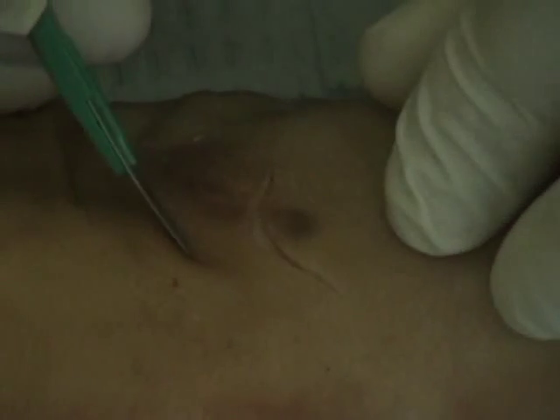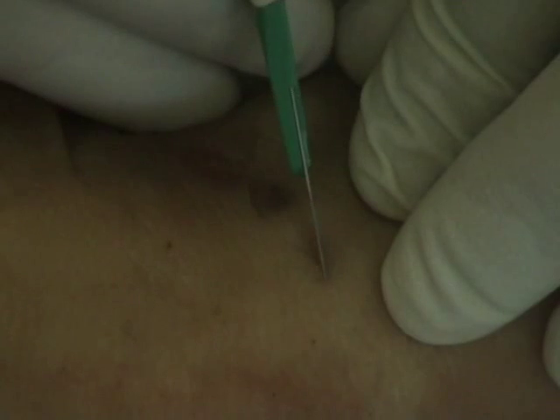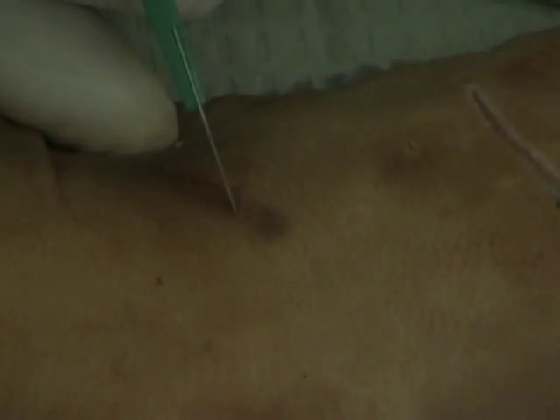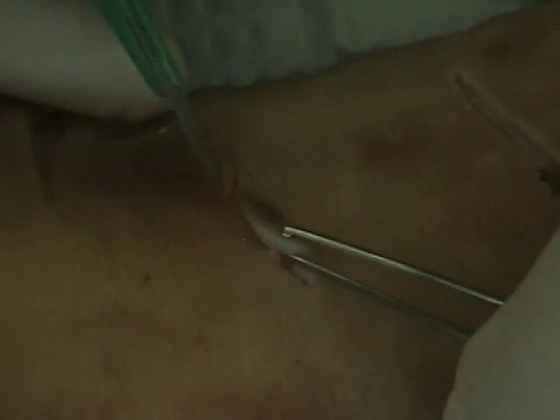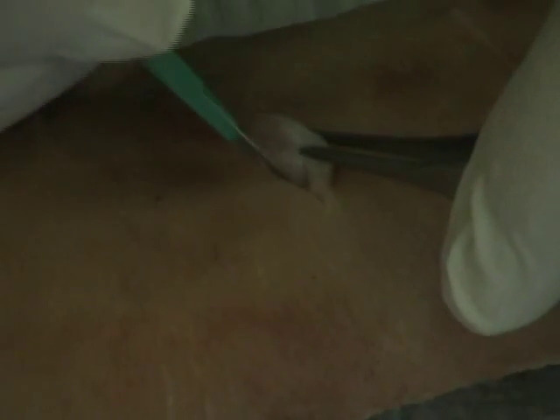and curve it like this. See this curved on one side. I then cut straight across the other side. And again, I can support the skin as I need it. Okay. Coming across to the other side like such. So I've taken out a curve of skin or a hemisphere, so to speak, of the skin from this patient.